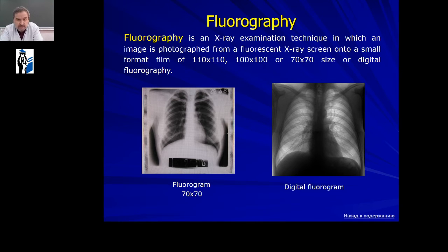The format of 100 by 100 millimeters is also named large frame fluorography.